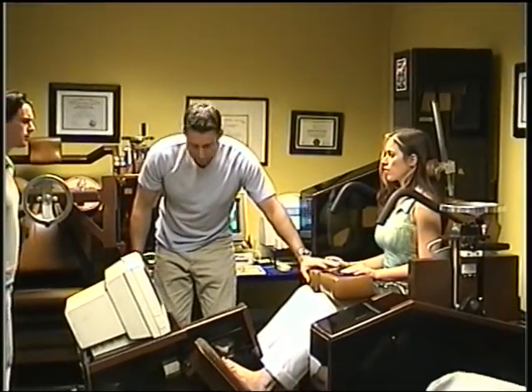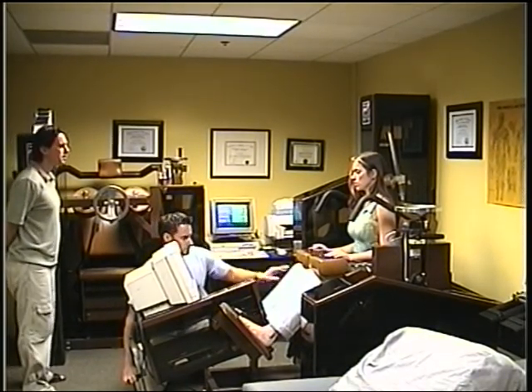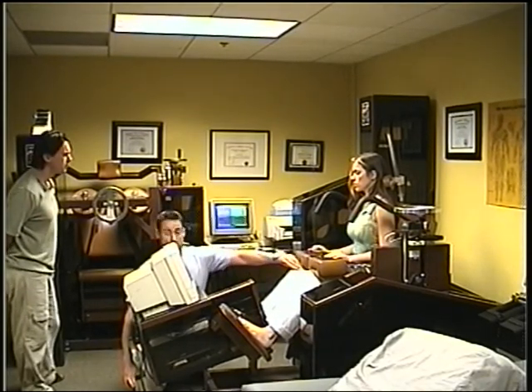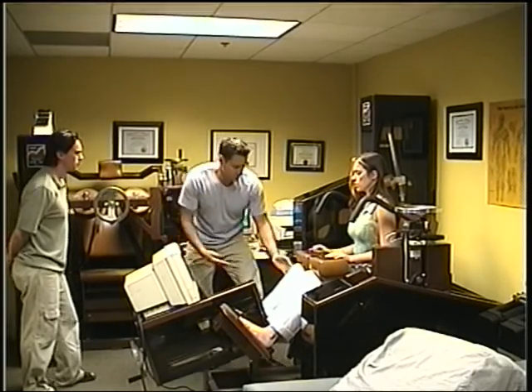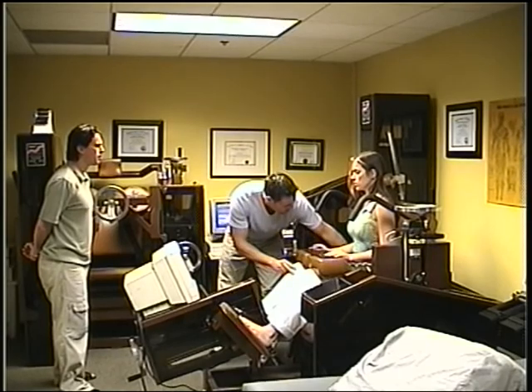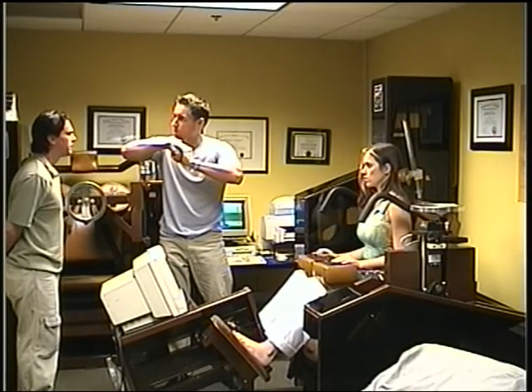The lower thigh is locked into place, and actually by using this swivel pedestal, if you will, we can drive the lower leg up, which basically reflects the tibia here, the bone in the bottom of the leg, through the knee joint, attaches to the femur, which is the main bone in your upper leg. Now the femur is then driven back, all the way back through this sort of deflection of this bone coming up and pushing underneath this pad. It's deflected into a lumbar restraint, or a lumbar roll back here, and that effectively takes the pelvis and just locks it into place underneath the roll.